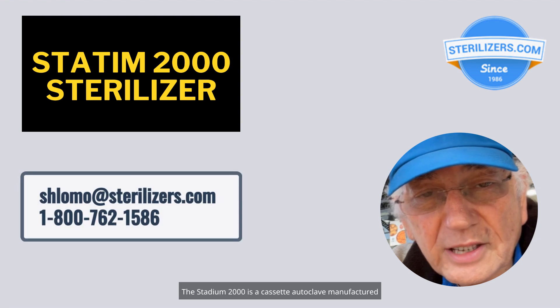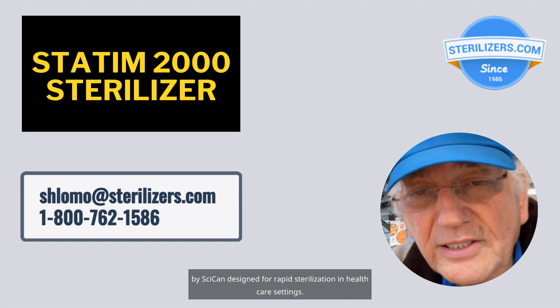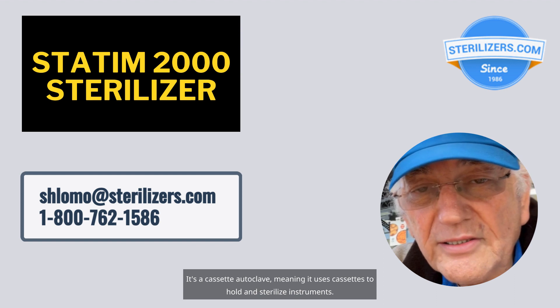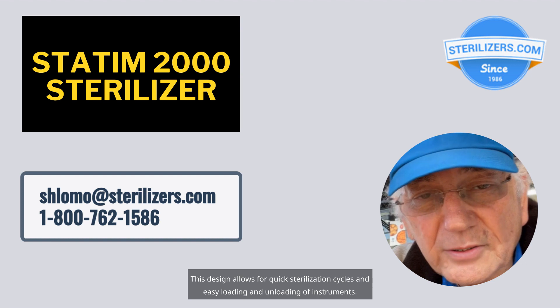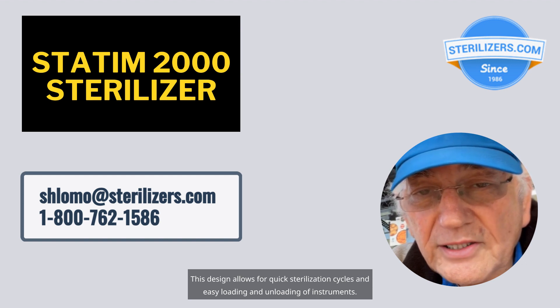The Statim 2000 is a cassette autoclave manufactured by SciCan, designed for rapid sterilization in healthcare settings. It is a cassette autoclave, meaning it uses cassettes to hold and sterilize instruments. This design allows for quick sterilization cycles and easy loading and unloading of instruments.